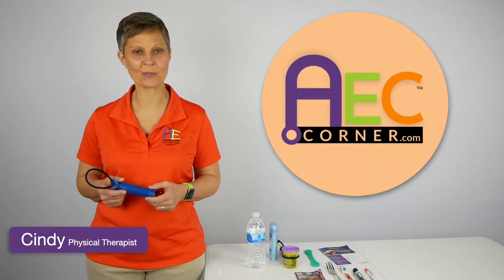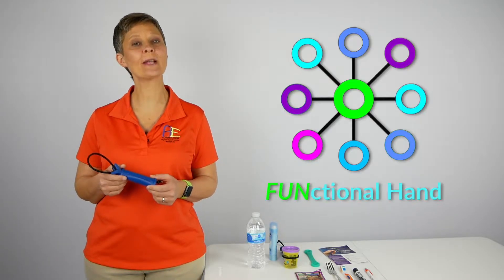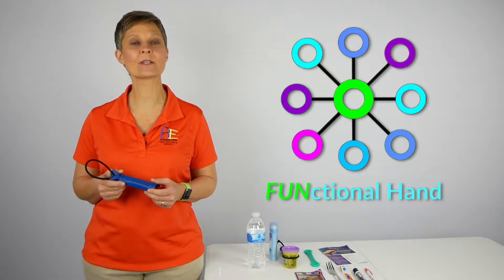Cindy here, Physical Therapist with Adaptive Equipment and Caregiving Corner. Today we are going to take a look at a product called the Functional Hand that was given to us for review by TheraSolutions.